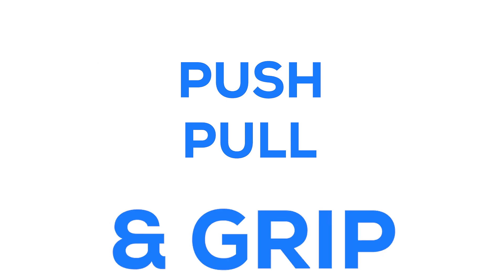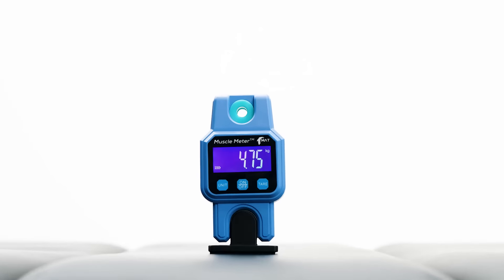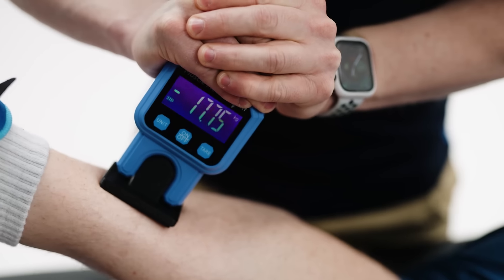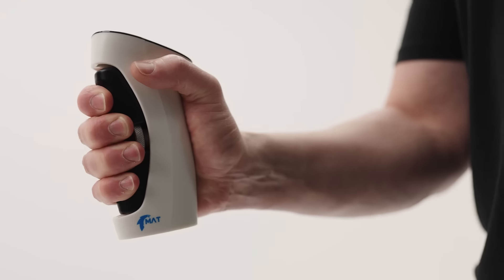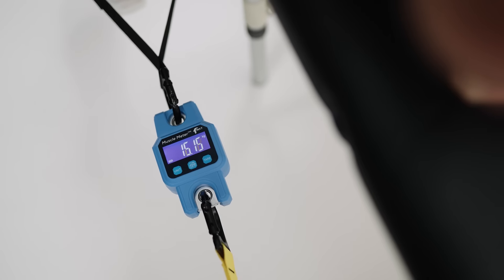Introducing the world's most intuitive and affordable push, pull and grip muscle strength tester — the Muscle Meter. This pocket-sized device allows you to measure almost every muscle in the body and provides you instant results on the device.